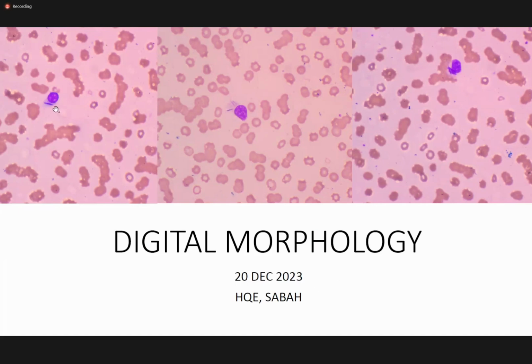Can you appreciate these three pictures? You mean the rods inside plasma cells? Yeah.